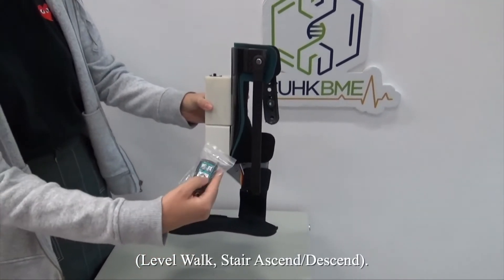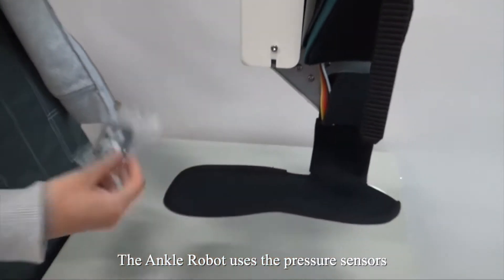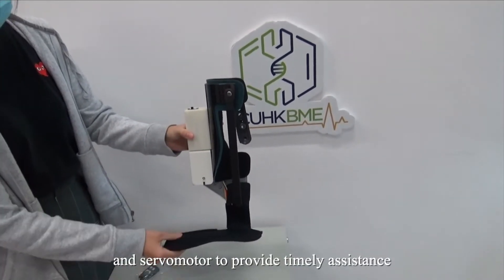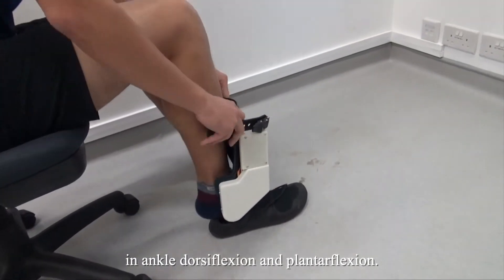stair ascend, and stair descend. The ankle robot uses pressure sensors to detect the user's gait pattern and a servo motor to provide timely assistance in ankle dorsiflexion and plantar flexion.